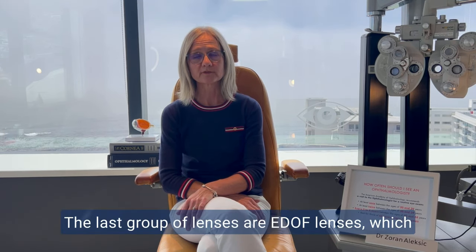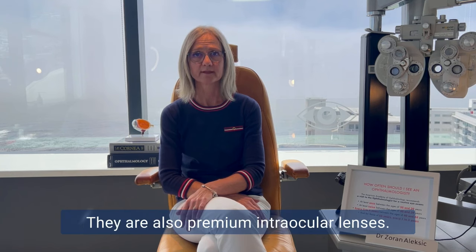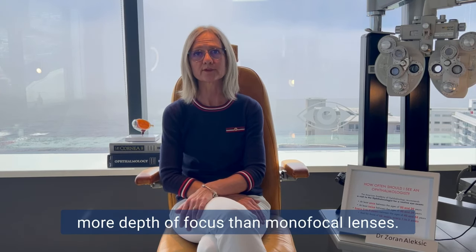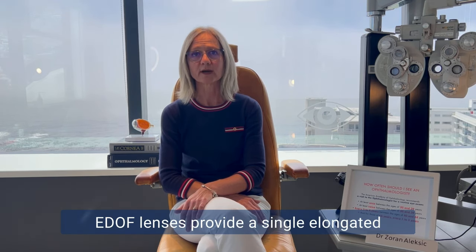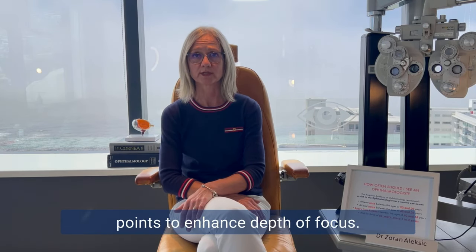The last group of lenses are EDOF lenses, which is short for Enhanced Depth of Focus lenses. They are also premium intraocular lenses. They are not multifocal lenses, but they offer more depth of focus than monofocal lenses. EDOF lenses provide a single elongated focal point rather than multiple focal points to enhance depth of focus.